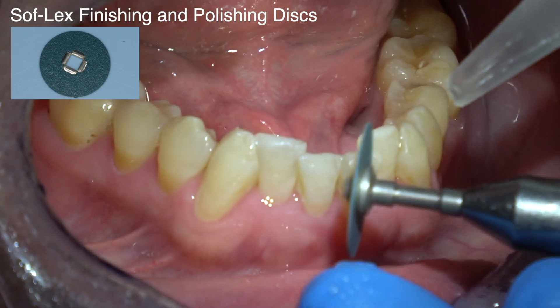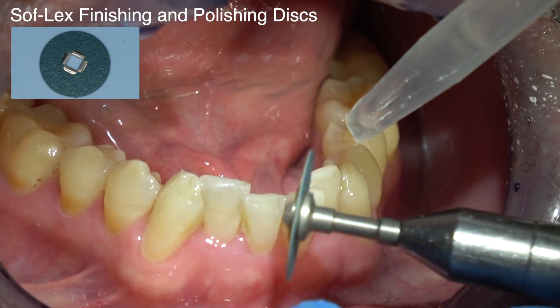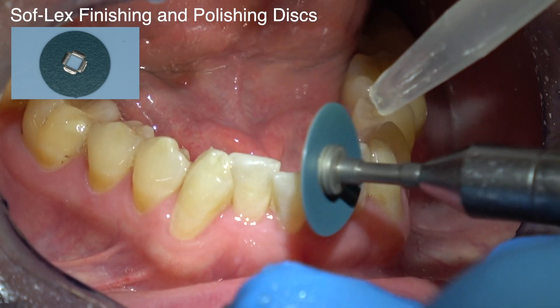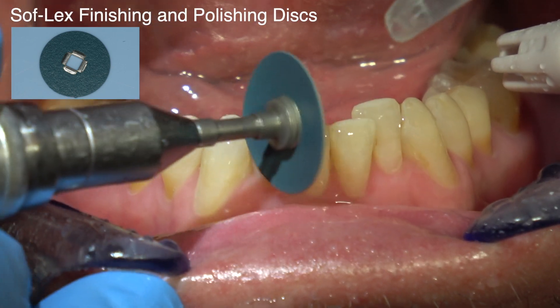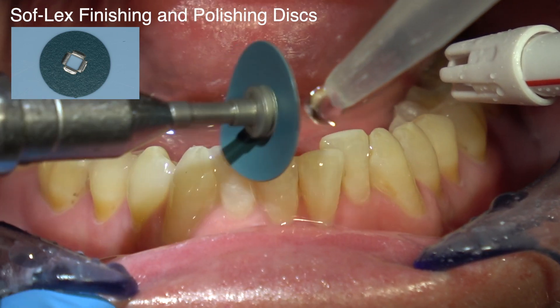Same thing down here. Notice how we drip water on it — it just lubricates it a little bit and it seems to polish a little better. It's polishing from the composite to the tooth. These lip protectors are really valuable — protecting the lip and keeping that out of the way.